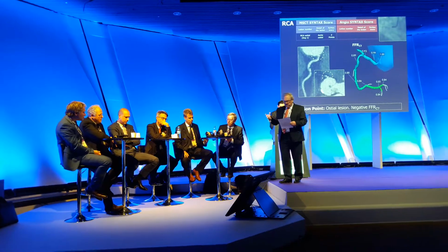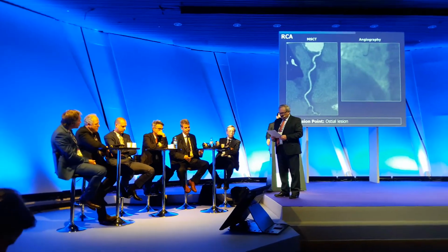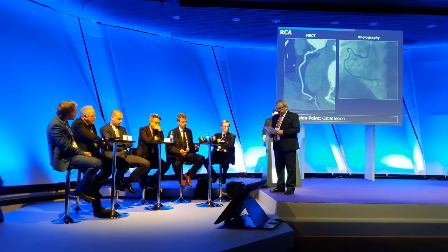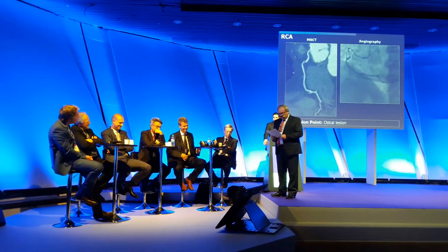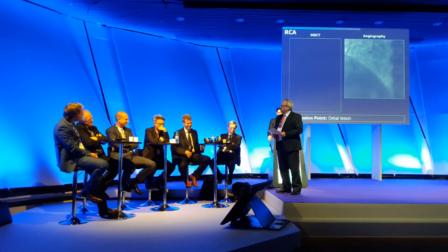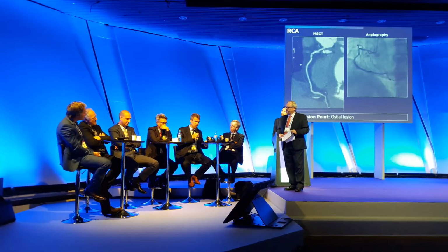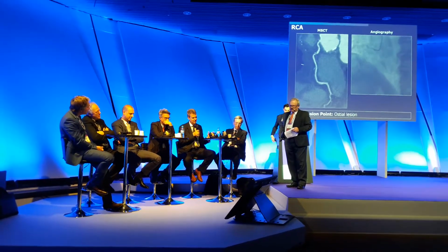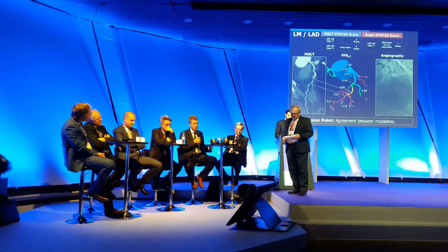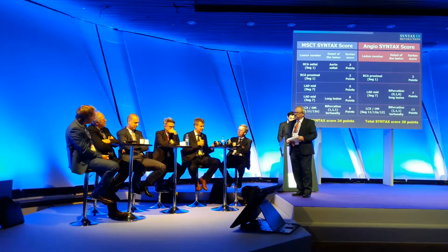So in the meantime, the radiologist Daniele Andreini has discovered the conventional angiography. What did you learn specifically from the cine angiography? You will say probably nothing, but it's up to you. But does it help to make your judgment? Yes, thank you, Professor. So I think we saw that we have a very good agreement between CT and invasive angiography regarding left main, LAD, and circ assessment.